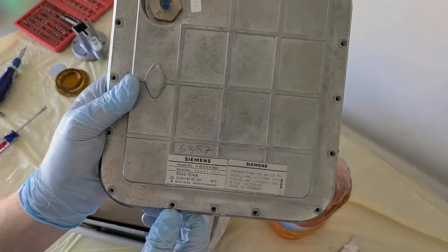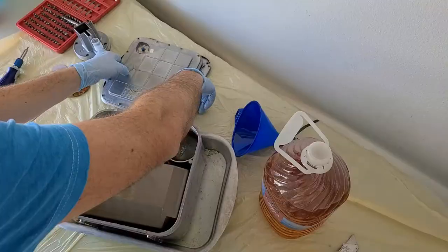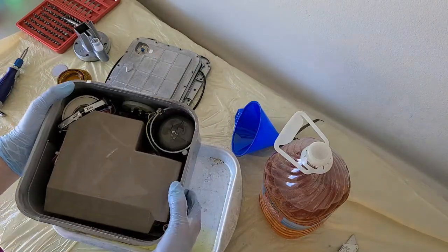Looks like this tube here again. 90 kV, 12 milliamps. All right, so here we have it. Let's go ahead and take off the guts of the system.